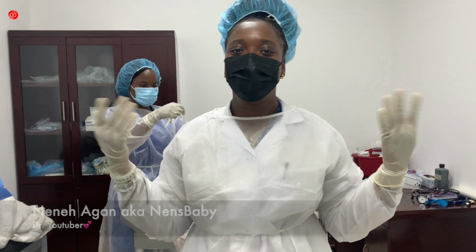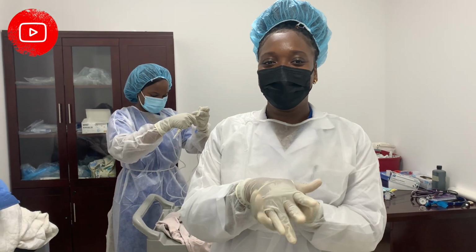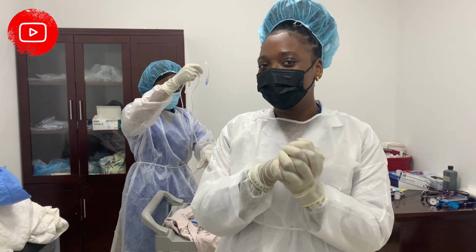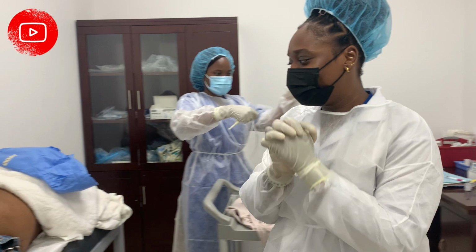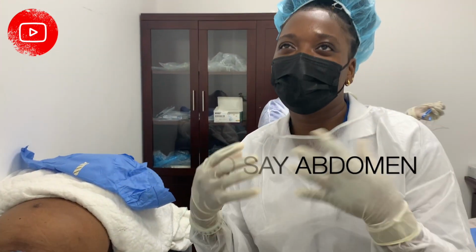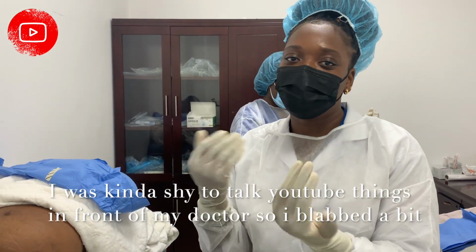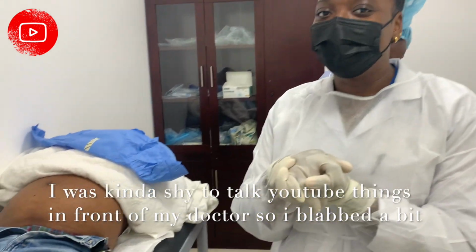Hi guys, my name is Nene Agan, and I'm going to be doing my first paracentesis procedure today. Basically, I'm going to be tapping this patient's stomach to get out some fluid. It's a relieving procedure for this patient. Yes, that's what I'm going to be doing today.